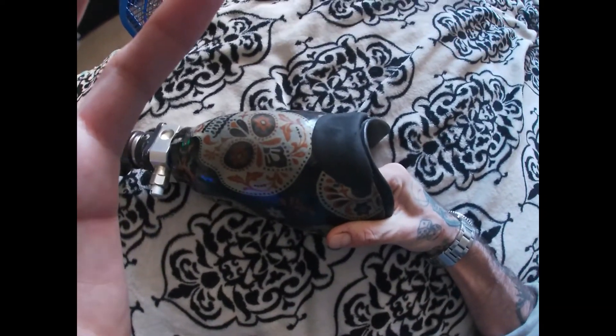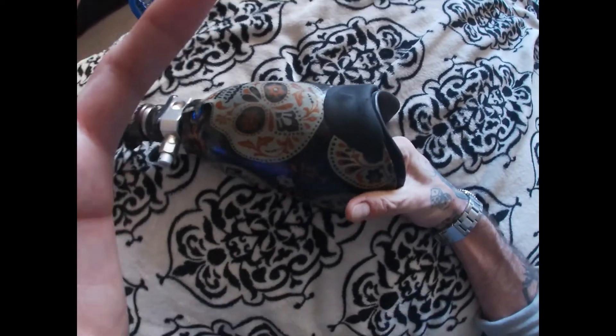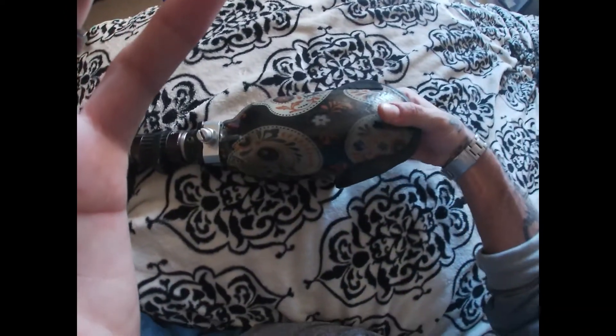That's a simple little modification that they can do there that will keep the integrity of it looking nice and clean.